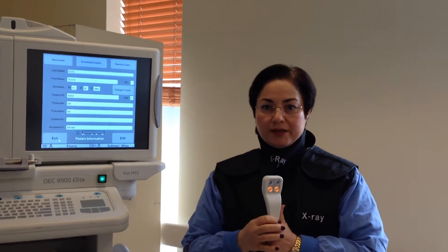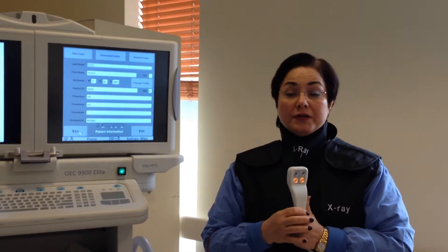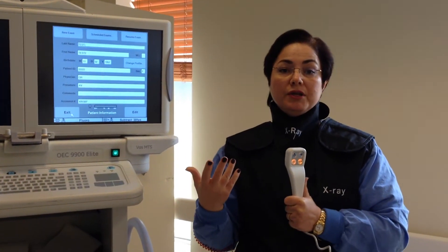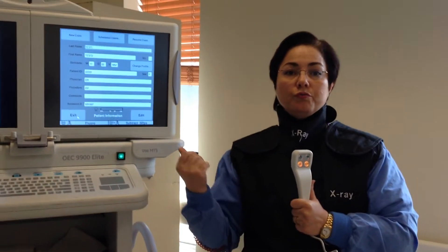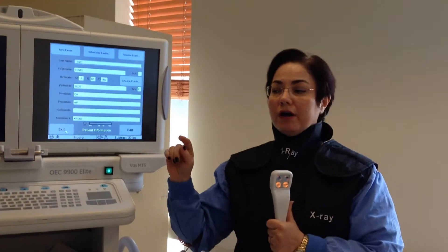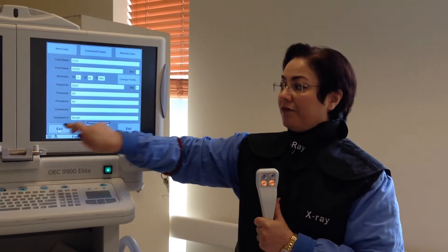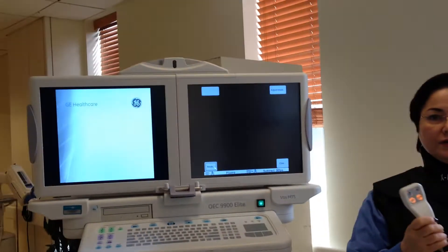Now we are ready for the subtraction case. First, the doctor is going to tell me to fluoro to make sure that, after exiting the page, I am in the right place.